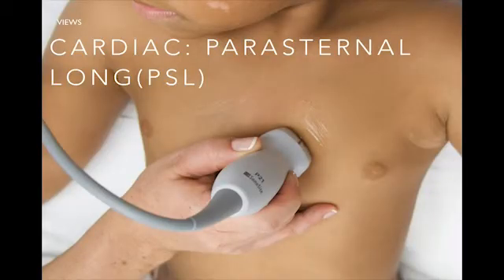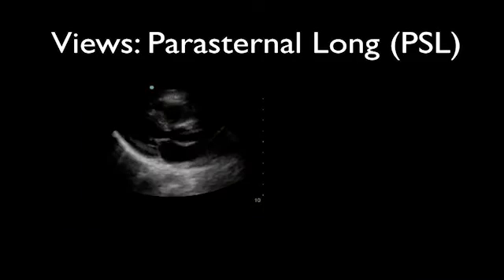So I mentioned parasternal long axis as an alternative view. Now again, if you're doing compressions, this is not ideal. You want to minimize pauses in compressions. But for a lot of other things, if you have a stable patient, you're looking at the parasternal long axis, and this will give you a systematic way of evaluating for contractility. So luckily, Brett and I both do the same orientation for the probe and the indicator. So indicator for parasternal long axis is 4 o'clock. And this is what you're going to see on the screen.